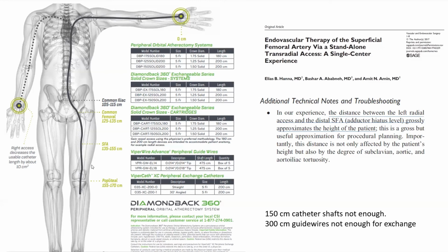So it's extremely important to know for you to plan your procedure and to know what catheter I need to do and whether you can balloon that lesion and what balloon shaft and catheter shaft you need. Okay, so important to memorize this.